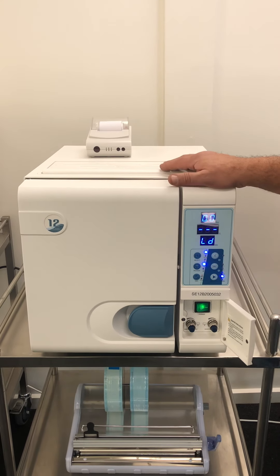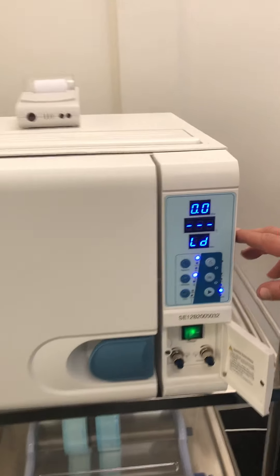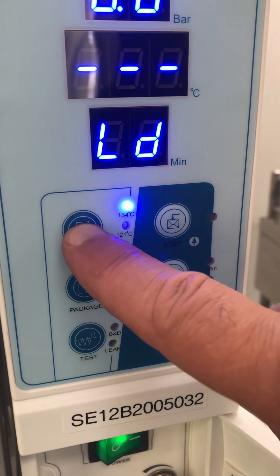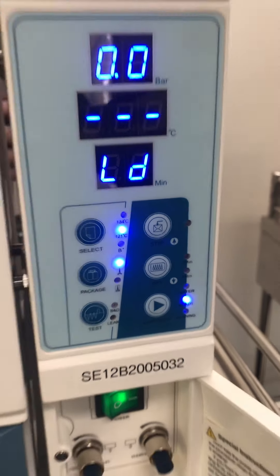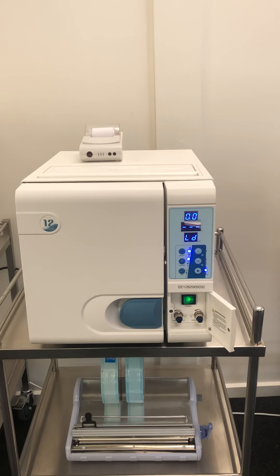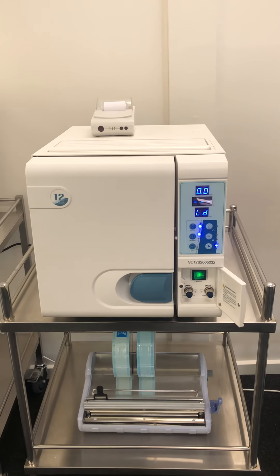There is also a plastic and rubber cycle where you can sterilise at 121 degrees — down from 134 to 121. This does have a longer sterilisation cycle: it's 20 minutes, but it won't melt your plastic or rubber instruments.